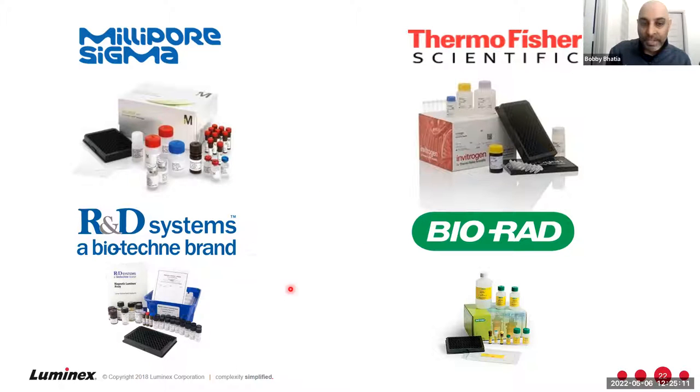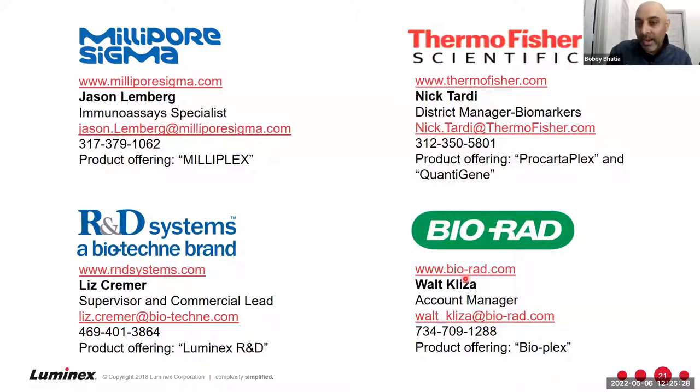All four of these companies' kits do provide standards and kit QCs. And that's the beautiful part to help you understand, hey, do these assays work or do not work? How are the standard curve ranges and so forth? And that's the other thing I want to mention about all four of these companies: go visit their website. They do have standard curve ranges. So especially if you have ELISA experience and you say, I had 200 picograms per ml of leptin or 1000 picograms per ml of IL-6 using ELISA, am I going to get the exact same numbers doing Luminex xMAP technology?